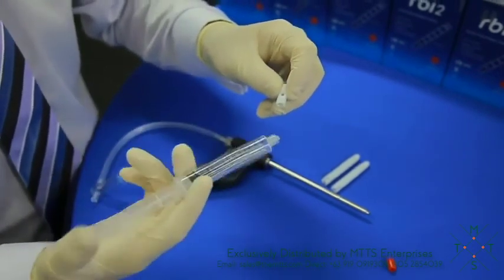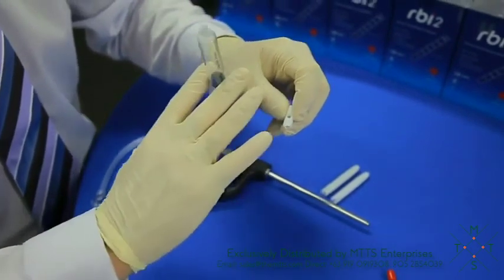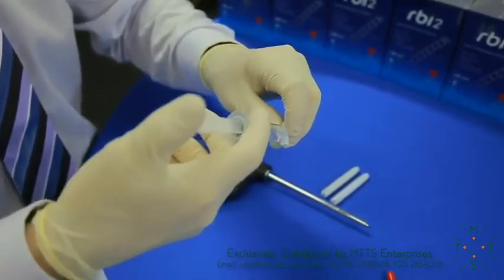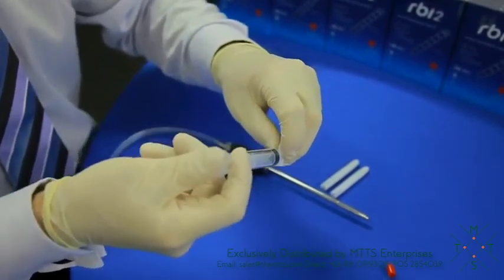If you place it from behind, you're going to actually tend to push the specimen deeper into the capsule. We want to come from the top and we want to give a really good quick push of saline.